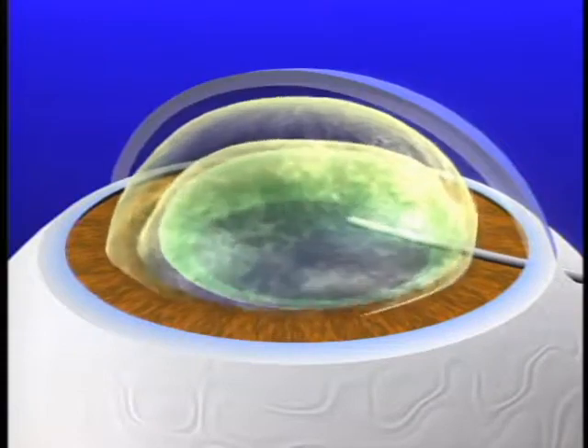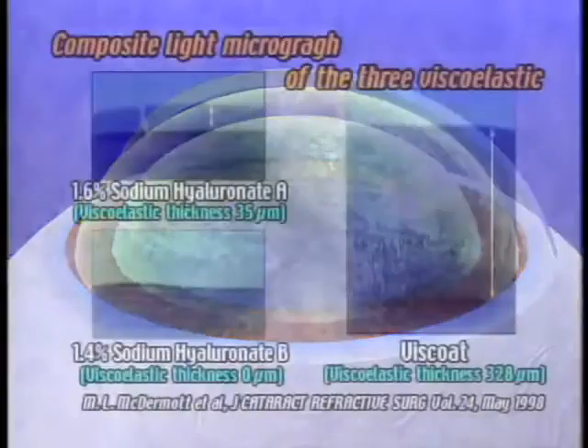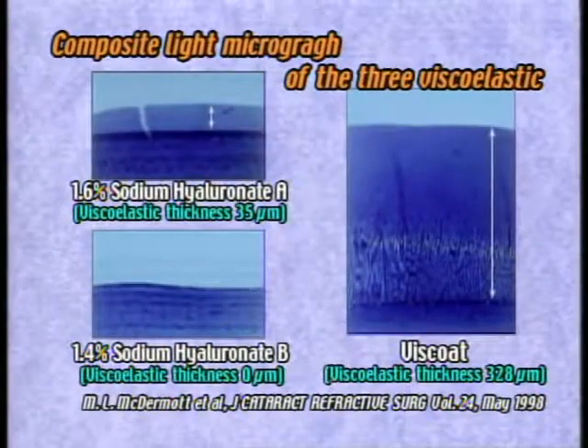This creates a layer of the dispersive viscoelastic material on the endothelium. As mentioned in the report by McDermott et al., it was verified that the dispersive viscoelastic material, viscote, was retained on the corneal endothelium after perfusion and aspiration during PEA. This video picture demonstrates that the layer of viscote remains on the corneal endothelium in a larger amount than any other viscoelastic material.